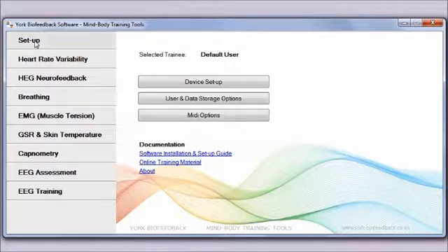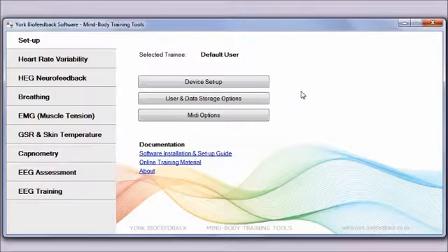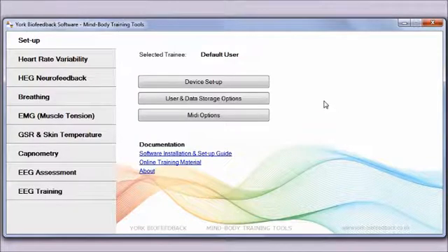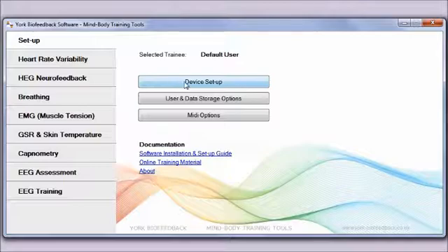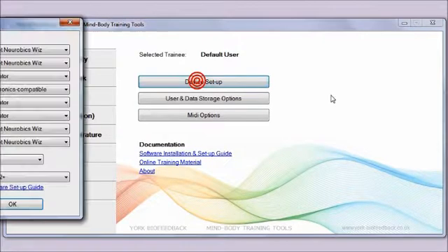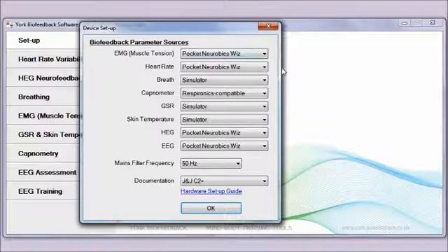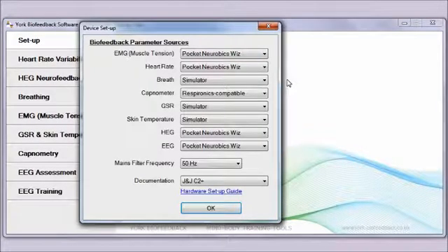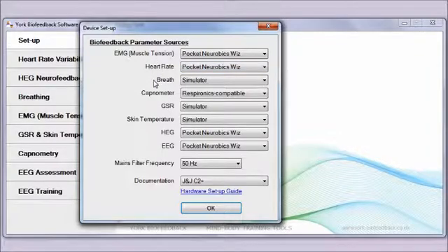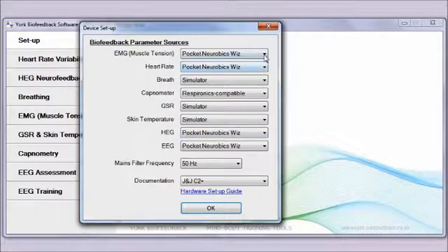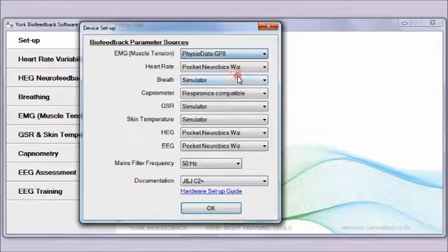From the setup tab, there are a couple of steps you need to do at the outset. The first is to configure your device, so I'm clicking this button here. I get a dialogue window that pops up. What you need to do is select the device that you're going to use for each of the biofeedback parameters.